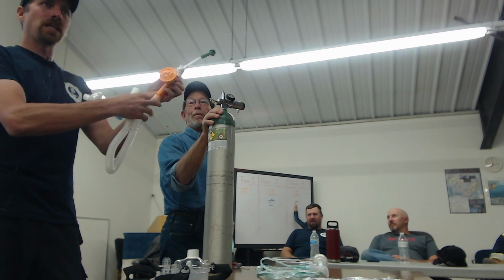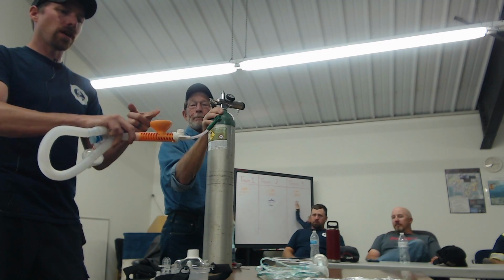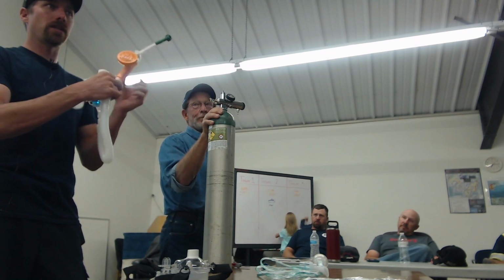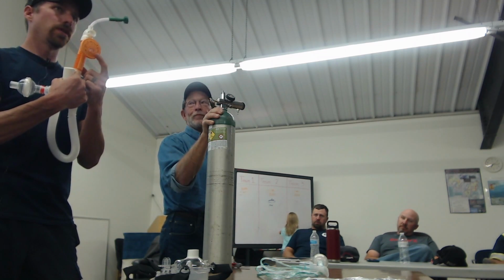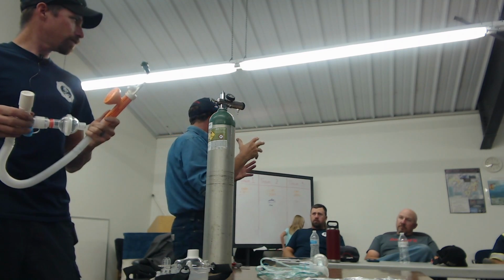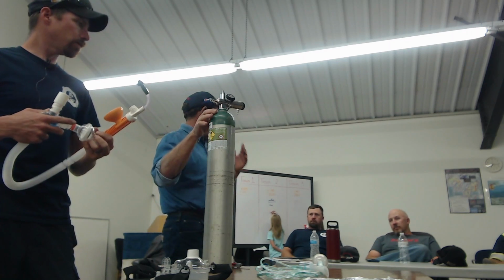So as that 15 liters a minute passes through here, it's also going to pick up another 125. That's a lot. 125 liters a minute through this filtered port. So that you're going to end up with 140 liters a minute actually traveling through this. Okay? This is what generates the pressure. It's keeping those airways open throughout the whole inspiratory cycle, in addition to the atmospheric pressure that's in our room.